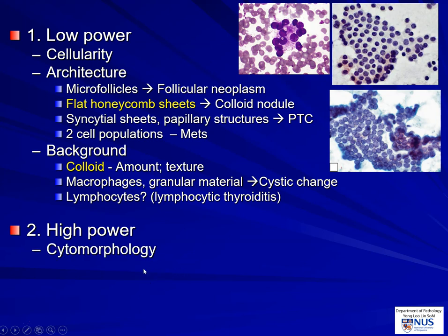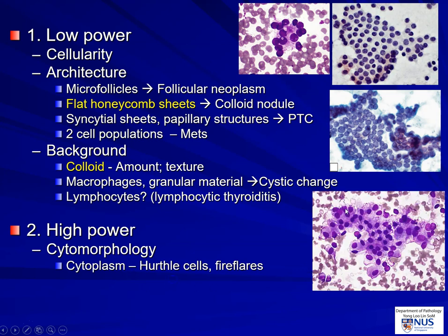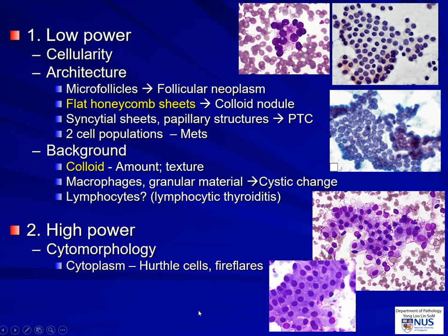On high magnification, we really want to focus on the cells themselves. In terms of cytoplasm, we can have cells with fire flares, which usually indicate metabolically active cells — they can be seen in neoplasms as well as in non-neoplastic nodules and Hürthle cells. And of course the nuclear features, specifically for PTC, medullary, and also very pleomorphic bizarre nuclei in anaplastic carcinoma.